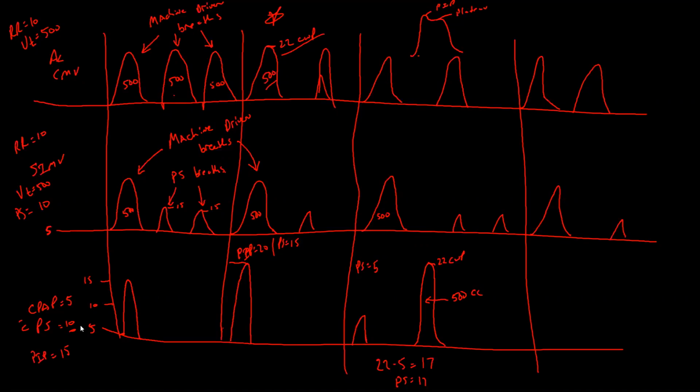Okay. So now when we come back to the middle section there, where we have SIMV, the reason why I've drawn those breaths smaller is to show that they are pressure support breaths at whatever we have them set at. If I want those to get bigger, I would increase the pressure support. But then if you had to do that, you just might as well have them in an AC mode or put them on a CPAP. Yes, in a lot of situations that's true.